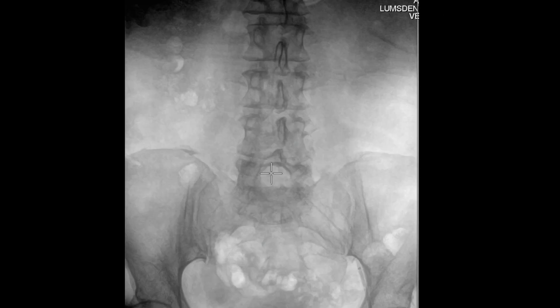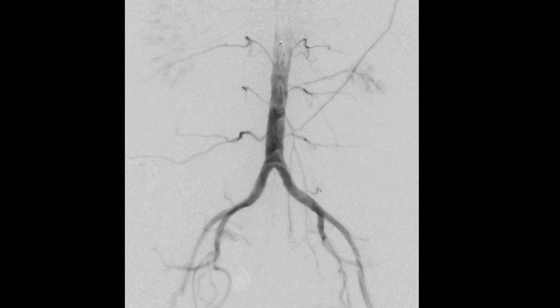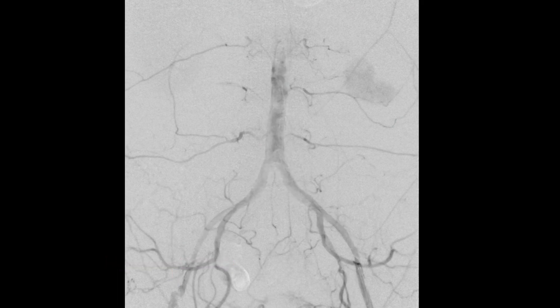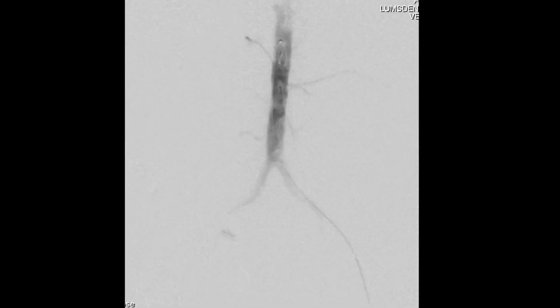We then proceeded with performing our abdominal aortogram and pelvic angiogram. This demonstrated a high-grade stenosis of the right external iliac artery just at the level of the pelvic brim, present at the distal segment of the external iliac artery.